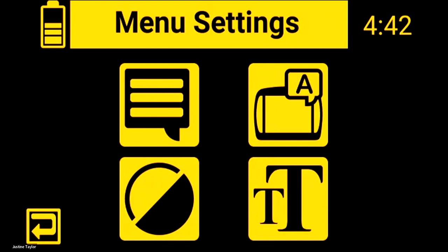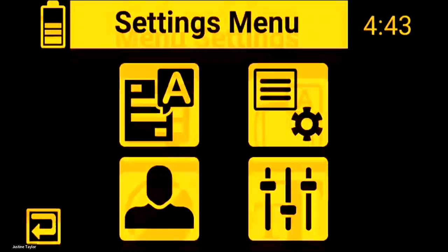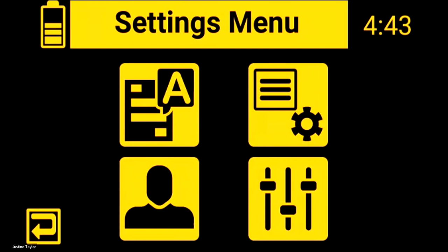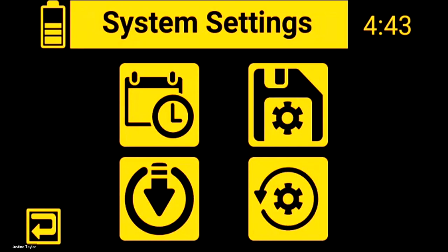In menu settings you can see the big T — that's where the text size is, and it goes up to like 72-point font. You can select what size is best for you or your student, and you can change the colors in the menu voices and all that good stuff.